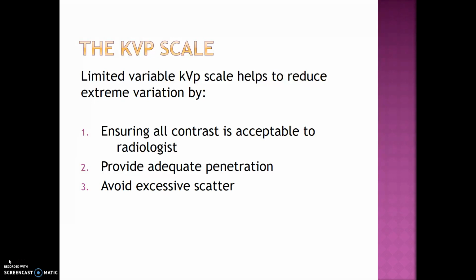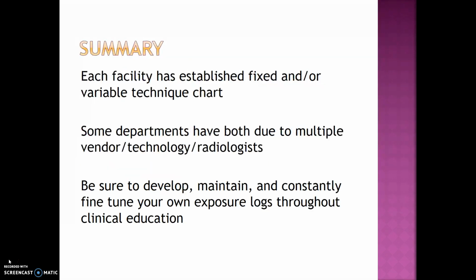A limited variable KVP scale helps to reduce extreme variation by ensuring all contrast is acceptable to the radiologist, providing adequate penetration, and avoiding excess scatter.